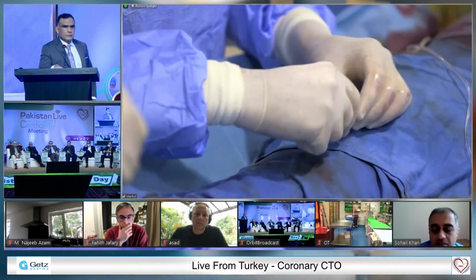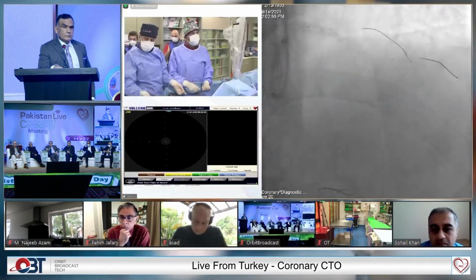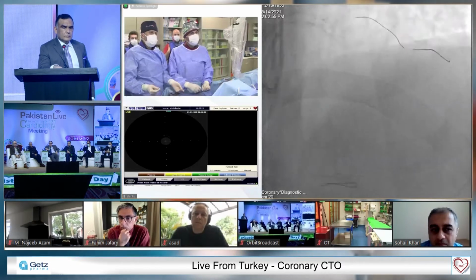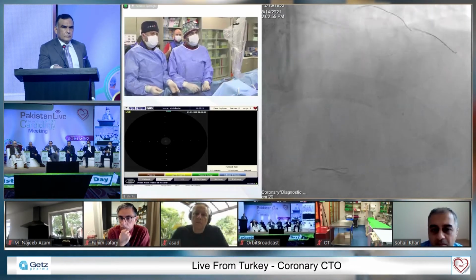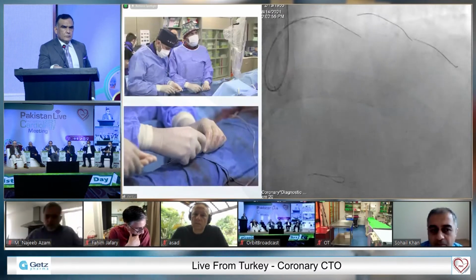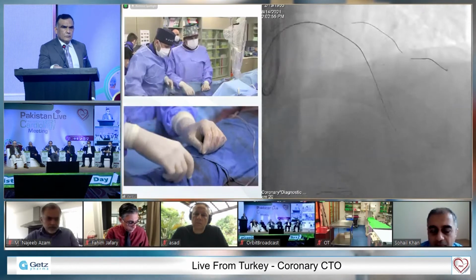He asked for Pilot 200. As you see, it's better than Gaia for the proximal part. But now, with this wire in place, I could send anything I want, which is Gaia or Miracle, for example.